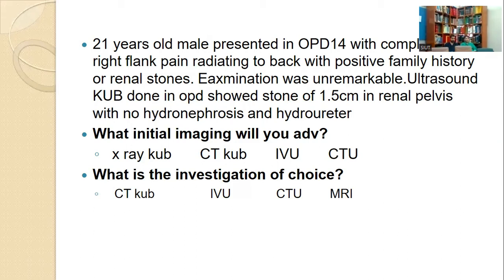X-ray KUB is not obsolete, because when you perform a CT KUB and the Hounsfield unit is 300 to 400, and you plan the management as ESWL, then what kind of ESWL? Under fluoro or ultrasound guided? There is a difference. If you simply write ESWL with a Hounsfield unit of 300 or 400, fluoro won't work. So make sure your management plan states ultrasound-guided ESWL or fluoro-guided ESWL.